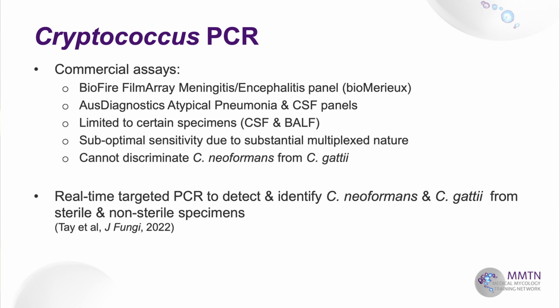And in our pan-fungal PCR, we had quite a lot of tissue specimens that were sent to histopathology because they thought it was a tumour, and on histopathology they then saw encapsulated yeast cells. So we had quite a lot of times where we were getting formalin-fixed tissue where people wanted to know whether it was neoformans or was it a gattii. And none of these commercial assays have the ability to discriminate between the 2.